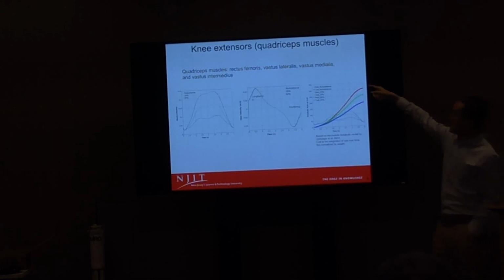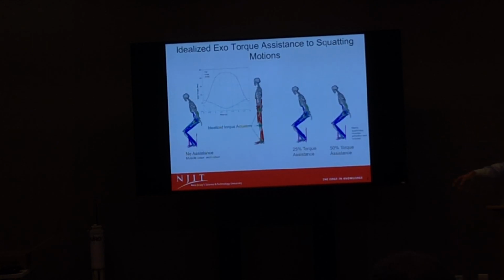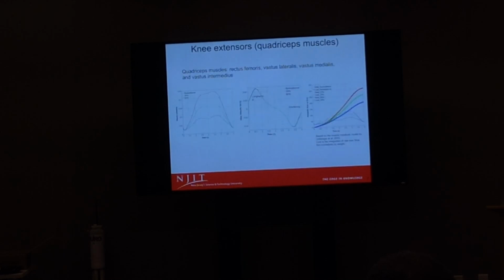It's very good results. But when I try to do the whole body, all the muscles, it's not as good, because the metabolic load comes from some of the hamstring muscles and the other muscles like the ankle muscles. So there is less reduction. It's still a profound reduction in intensive metabolic cost, but those are the main muscles which were reduced. So this basically tells us you can try to find a better actuation profile and see how that affects your muscle force, muscle energy consumption, and metabolic cost.